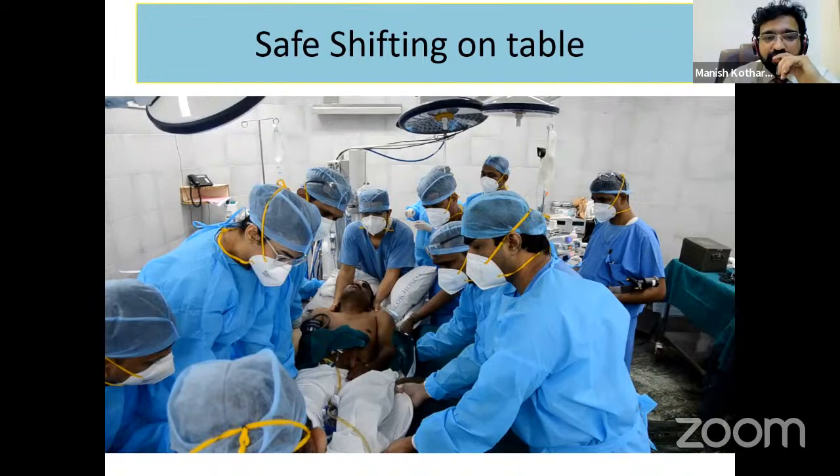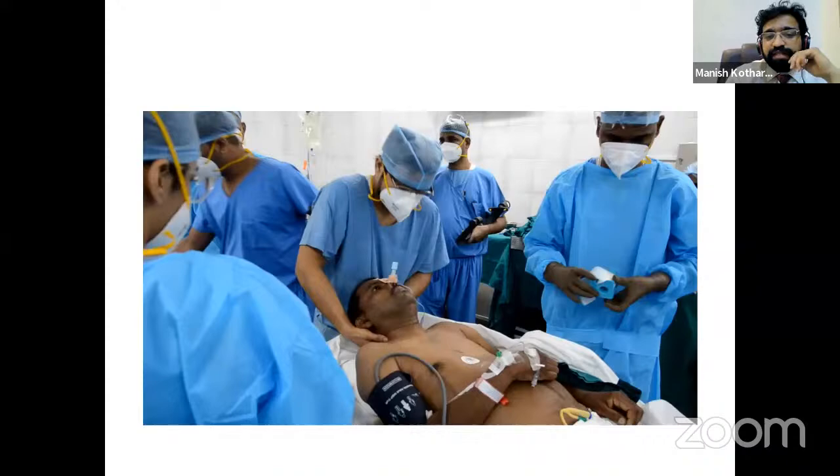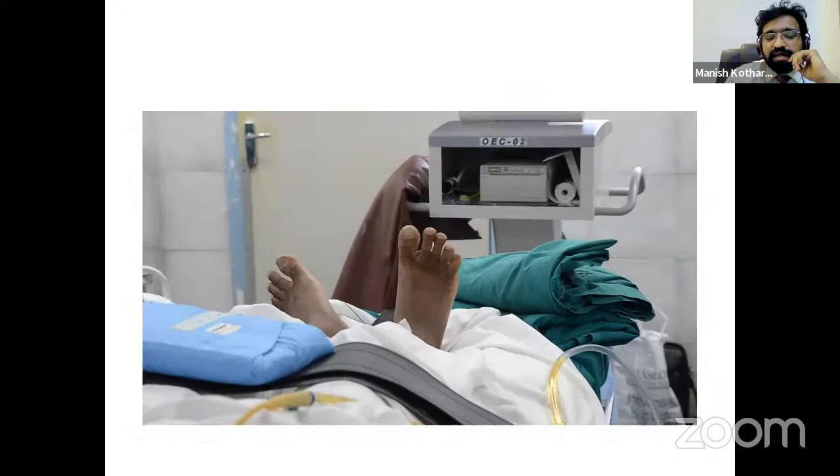And continuously, we are asking the patient to move his hands and legs to give us some indication if it is a safe positioning or not. Once he has been shifted, you see that I have not yet left the head of the patient. He's still under my hands, and my assistant is trying to give me support. I said, no, I'm not positioning till I find a good position. This is live neuromonitoring, till I find a good position before I fix him.